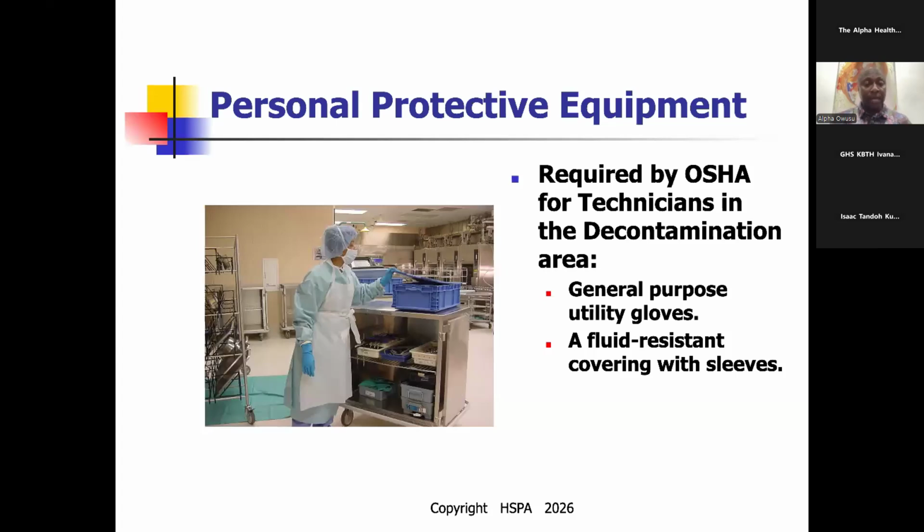And so again, PPE, specifically fluid-resistant covering sleeves. It has to come all the way here, and then your gloves should be all the way here. Very, very important. Your foot coverage should come to your knee. Specific PPE supplies, consumables, very, very important.